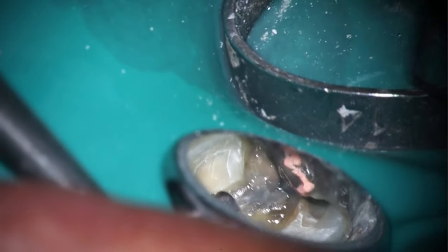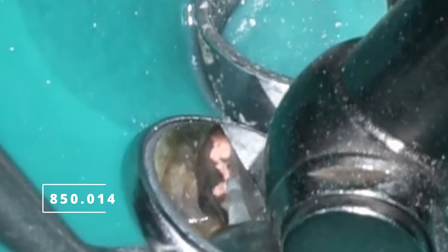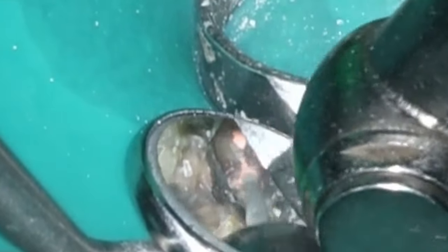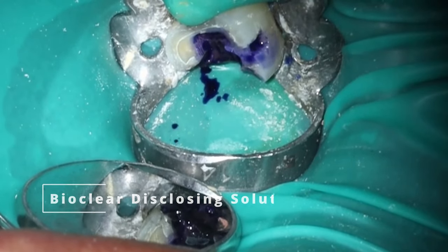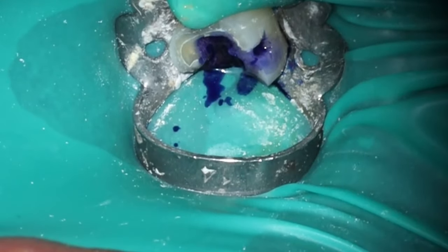When you pull the Pac-Mac out, you want to brush it against the wall. If you pull straight out, it's going to rip all the gutta-percha out with it and create a huge void. If you gently brush it against the wall, it almost pulls the gutta-percha off the Pac-Mac flutes as you're pulling it — a pretty interesting feeling. If you've tried the Pac-Mac in the past and hated it, that's my recommendation: go back and try it again because it's a very useful tool for voids like this. I noticed the distals were a little sloppy so I went in with the 850 to clean that up.